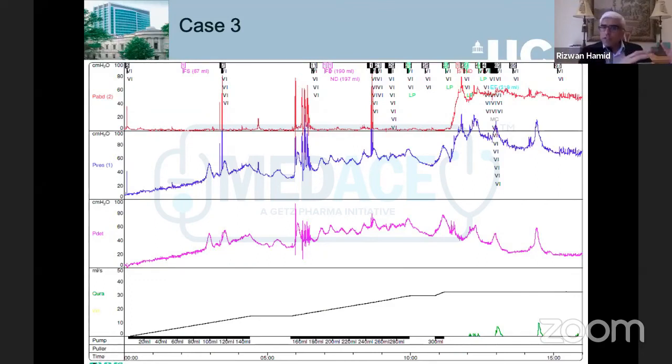So in this way, somebody who has got radiotherapy, stress incontinence, you have put an artificial sphincter, they are still having incontinence, you need to figure out that here you can see from very early on, as soon as you start filling, there's a loss of compliance, overactivity. So here the problem is the bladder. So if you concentrate, upsize the balloon, downsize the sphincter, that's just probably not going to be that helpful.